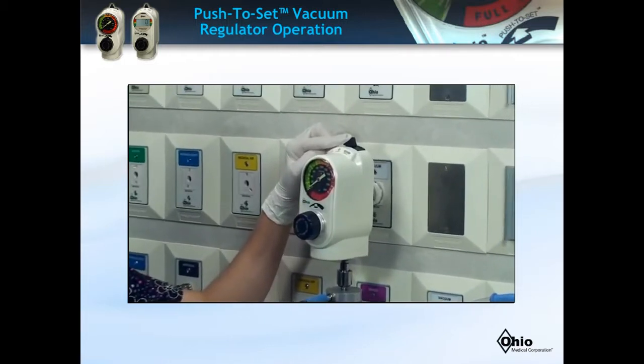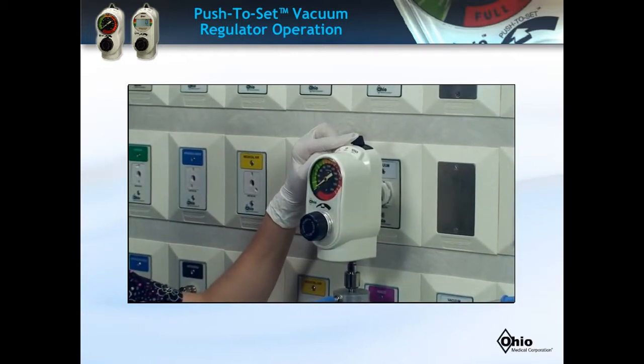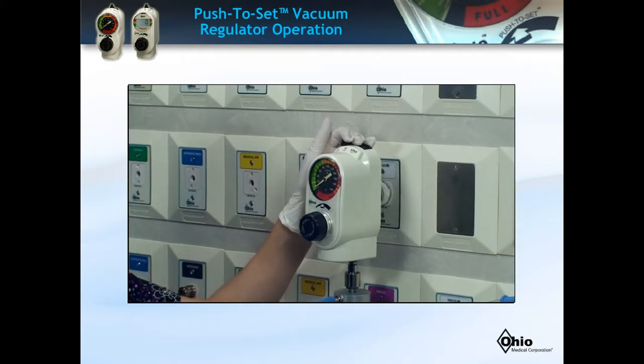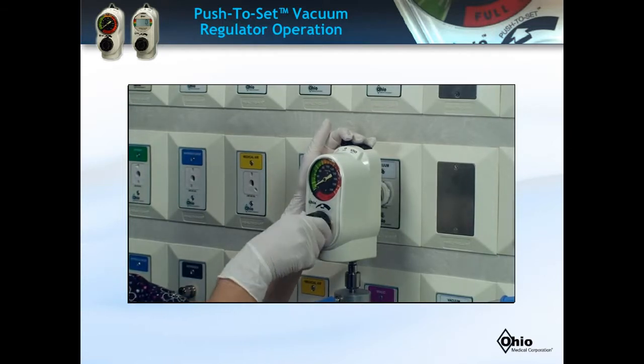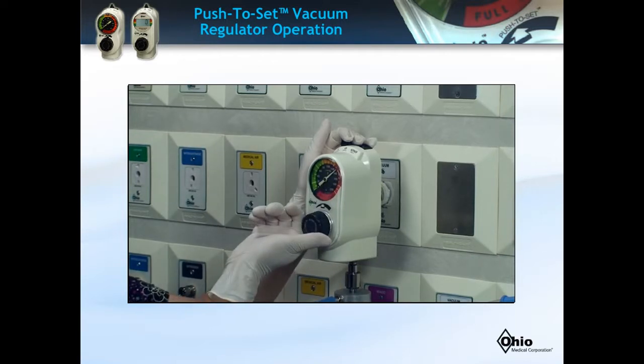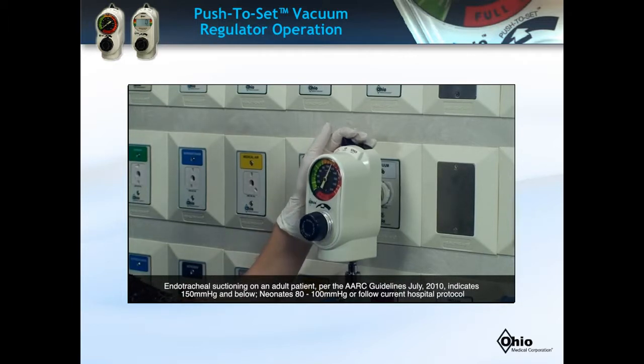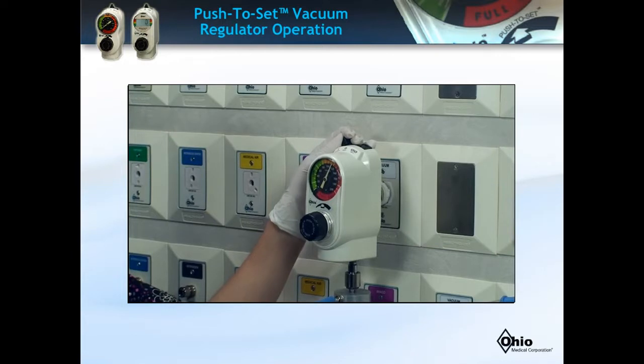Second, in the off position no suction is being applied to the patient. Third, turn the Mode Selector switch to the continuous position for an endotracheal suction procedure. Push and rotate the suction control knob until the vacuum gauge indicates the required setting, and release the knob. It is normal to see pressure drop on the gauge after releasing the knob as the system is open. By setting the pressure to a specific millimeters of mercury, you have now set the maximum pressure. You do not need to reset the pressure.